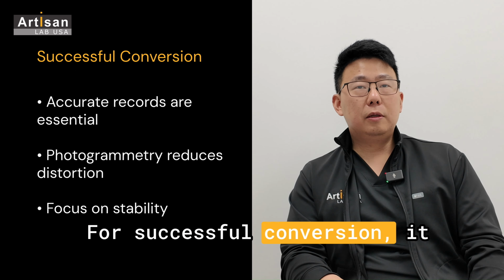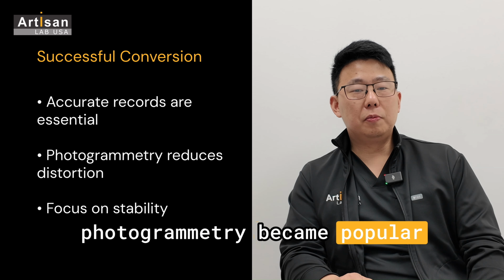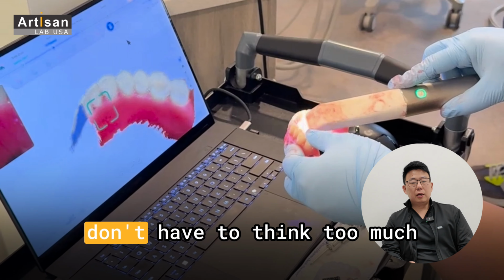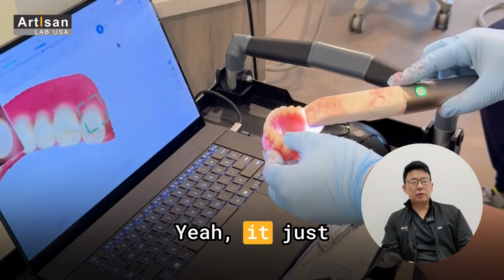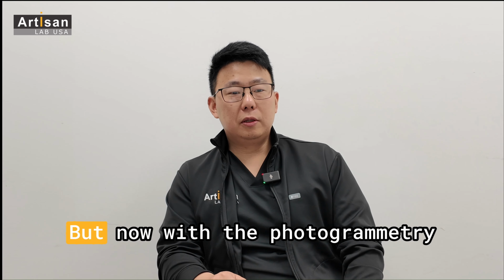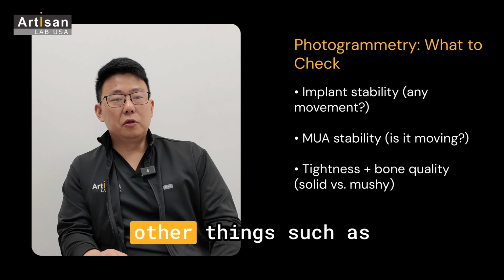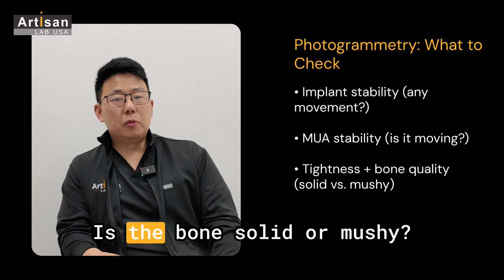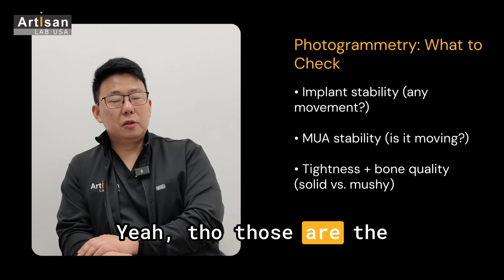Successful conversion depends on accurate data. Photogrammetry became popular and a hot topic because now you don't have to think too much about who's taking the record. It just became a lot easier. But now with the photogrammetry tool, we can think about other things, such as: is the implant moving? Is the MUA moving? Is everything tightened? Is the bone solid or mushy? Those are the things we can focus on more.